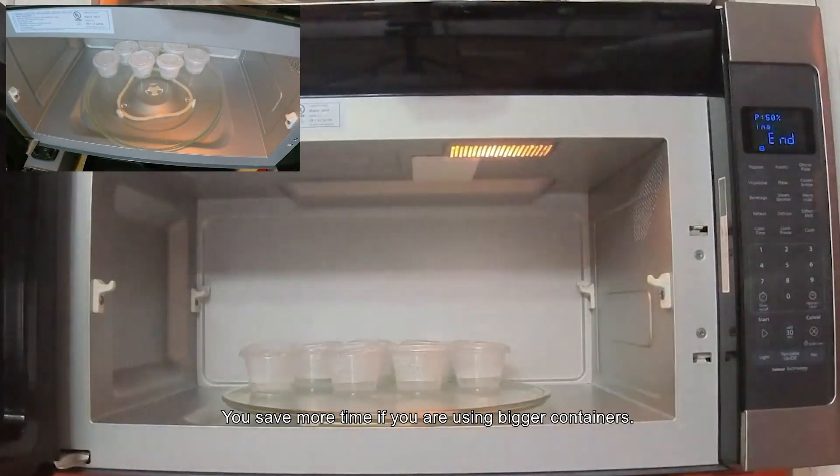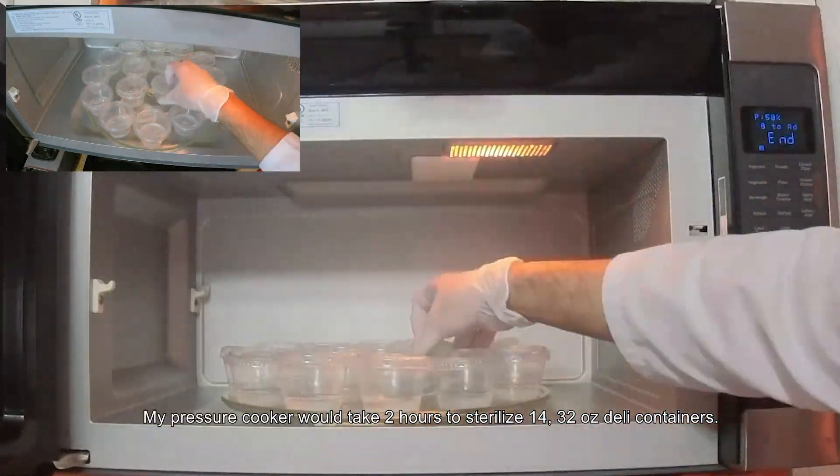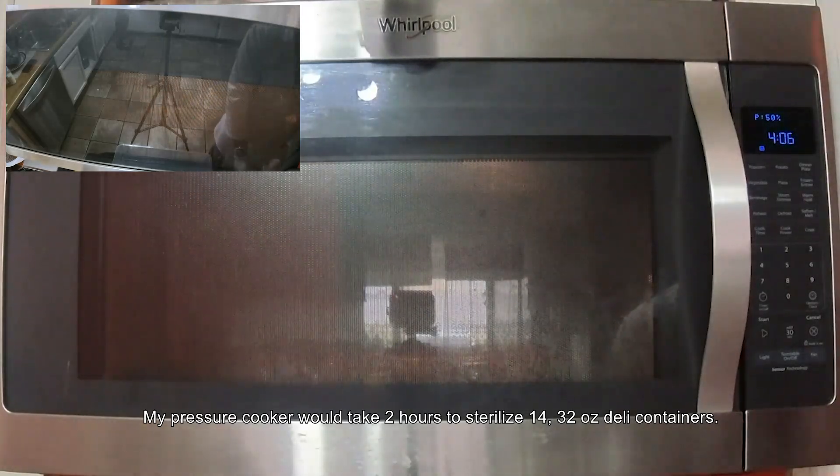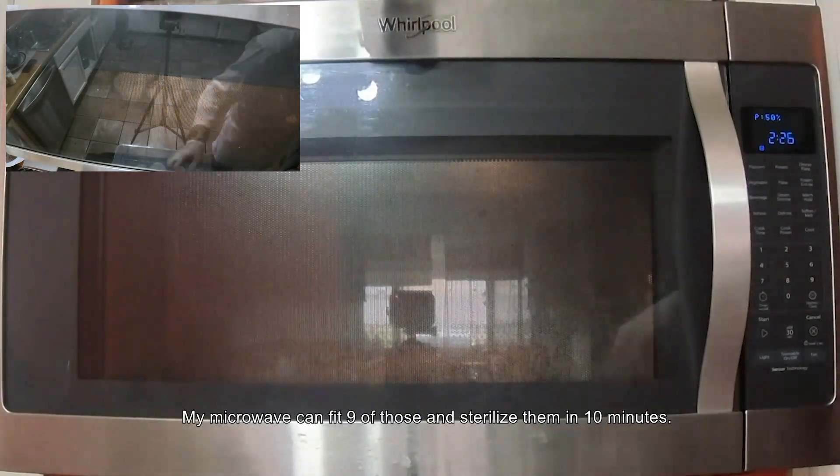You save more time if you're using bigger containers. My pressure cooker would take 2 hours to sterilize 14 32-ounce deli containers. My microwave can fit 9 or 2 and sterilize them in 10 minutes.